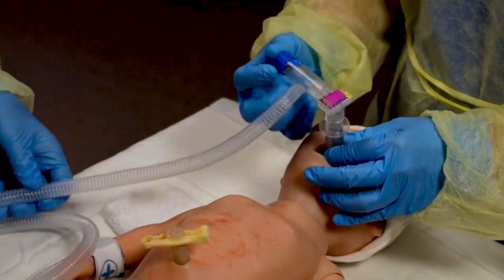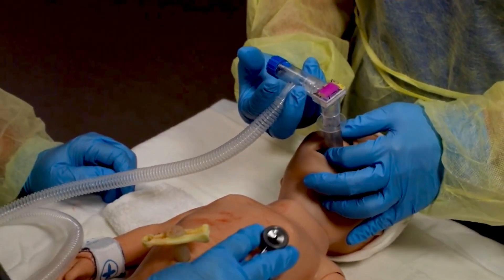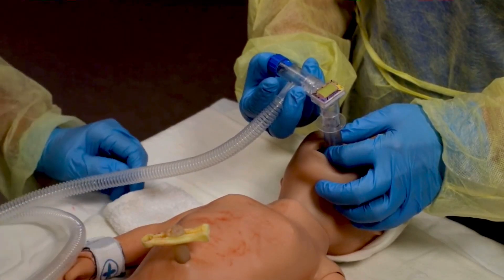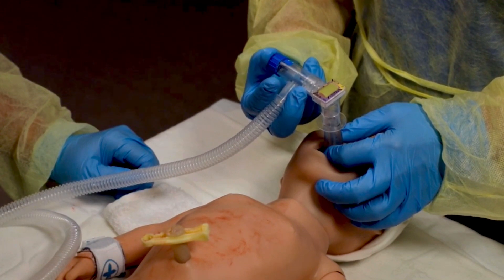Do 30 seconds of PPV with chest movement. Discontinue PPV when the heart rate is more than 100 beats per minute and the baby is breathing. If the heart rate is still less than 60 beats per minute after PPV with an alternative airway that moves the chest, start chest compressions.